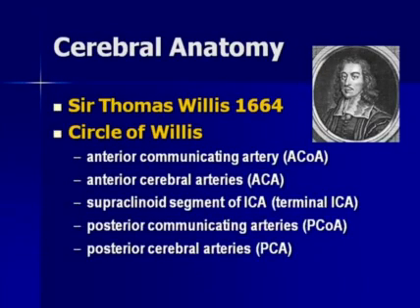To begin this discussion of transcranial Doppler, we'll start with anatomy, and that's important, obviously, to understand what we're looking at. Certainly, we all know about the Circle of Willis, and that was named after Sir Thomas Willis, who first described it back in the mid-1600s. And the Circle of Willis is comprised of 5 components, and you can see them listed here.